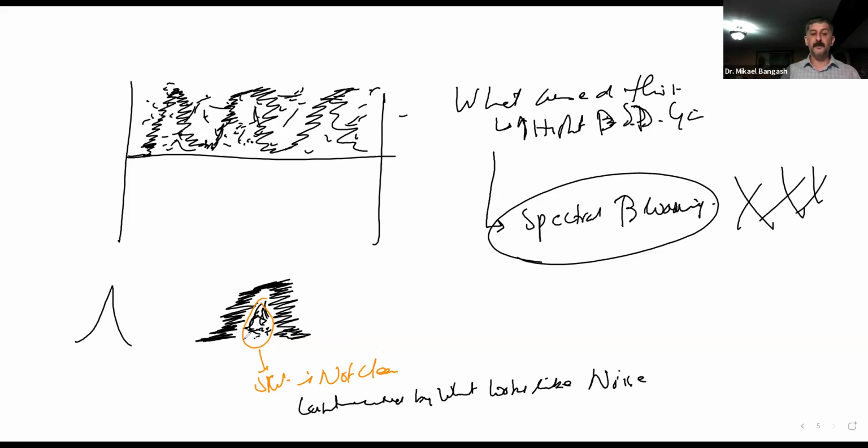So how would you differentiate between spectral broadening, which primarily, unless we are dealing with an imposter of it, should have meant that you had a turbulent flow, and too high of a spectral Doppler gain? It is that, my dear ladies and gentlemen, you will also see noise in areas outside the spectral window. These were your spectral windows here, right?